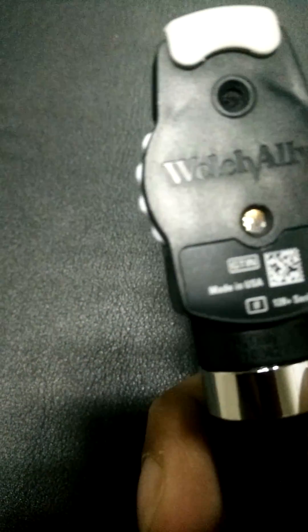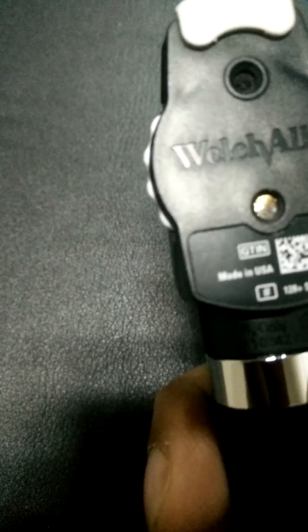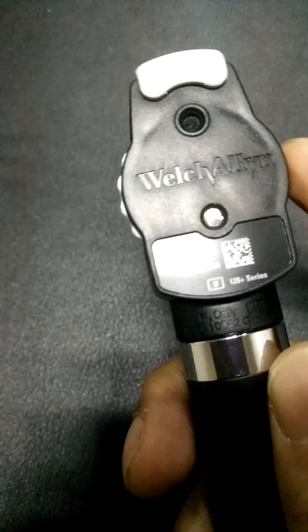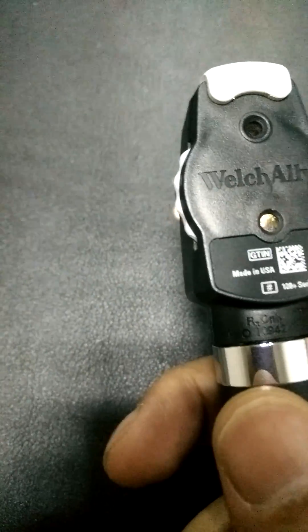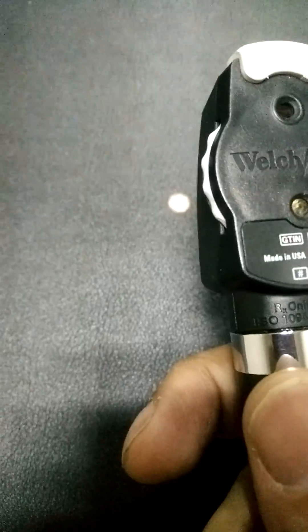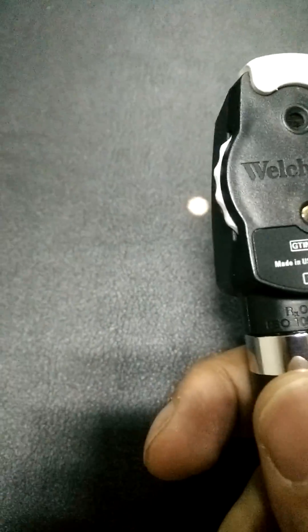Maybe start from zero and go up to plus 2, plus 4, plus 6, plus 8 — whichever you are comfortable with and gives you a clear view. But if you want to view the posterior chamber and the retina, then you will have to dial it down to the negative diopter, starting from zero and gradually changing the diopter settings to the point where you see the vessels clearly.